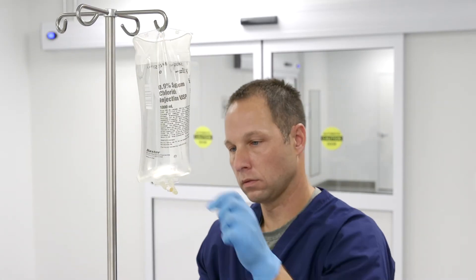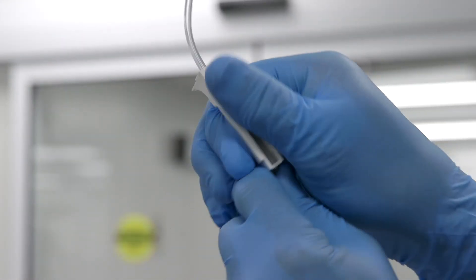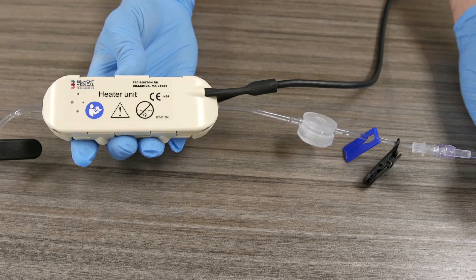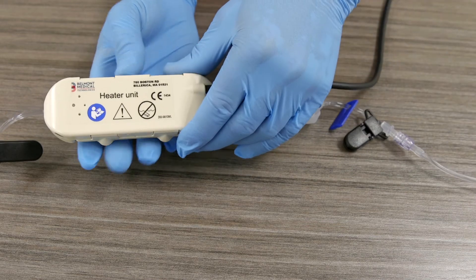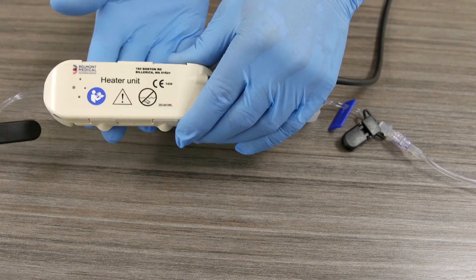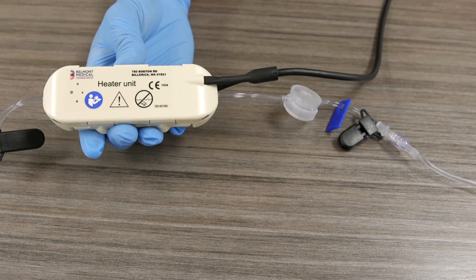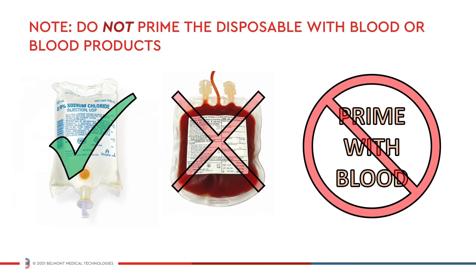First, hang and spike a fluid bag. Open the roller clamps of the administration set and prime the unit with saline solution, making sure that there is no air in the IV line. Tap the heater unit while priming to expel any air bubbles that may collect in the disposable. When you are sure that the disposable is primed and free of air, proceed to powering on the device. Do not prime the disposable with blood or blood products.